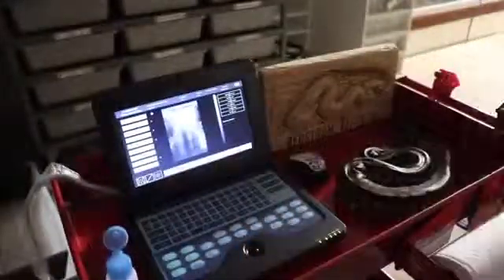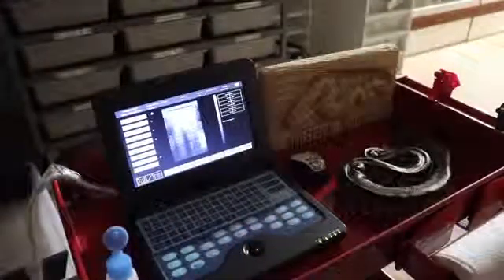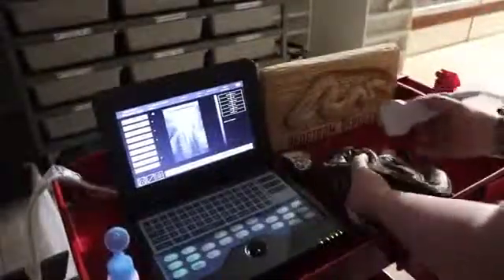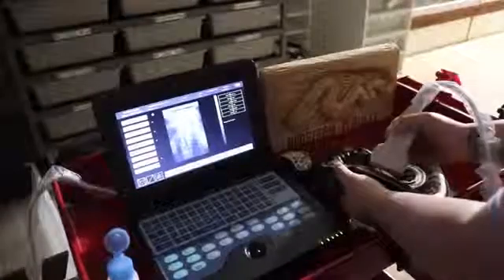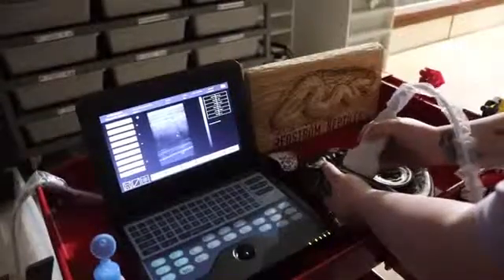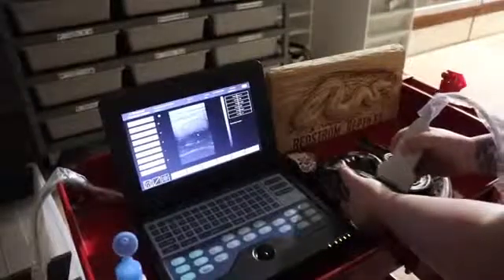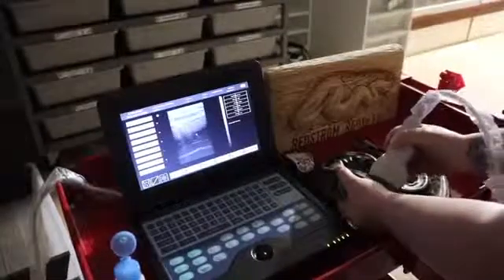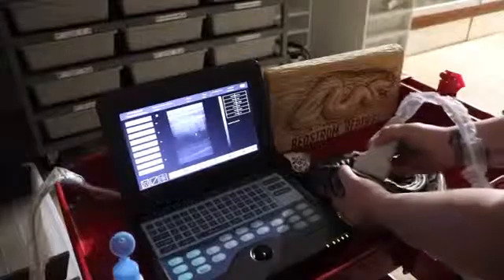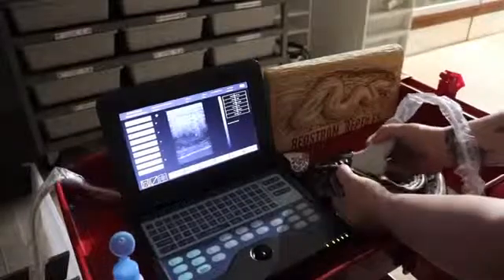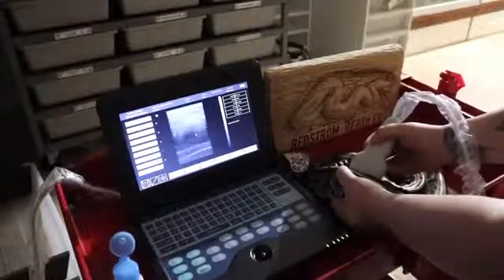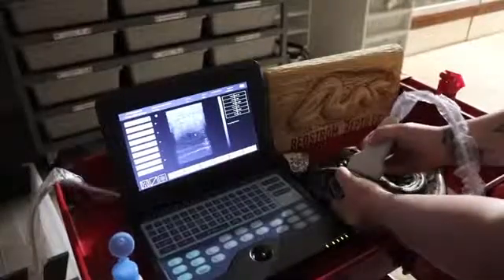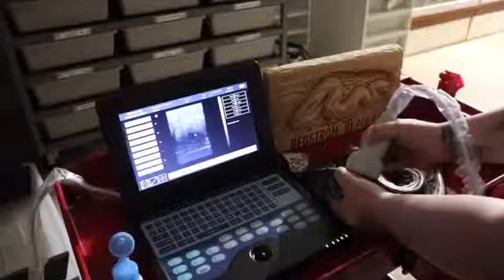So just gonna lather that on. Look at that, nice massively huge follicle. It's taking up the entire screen.